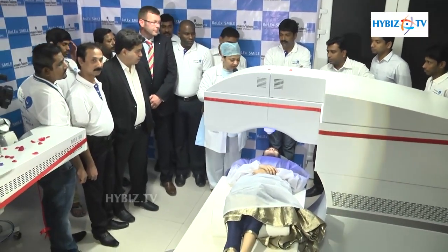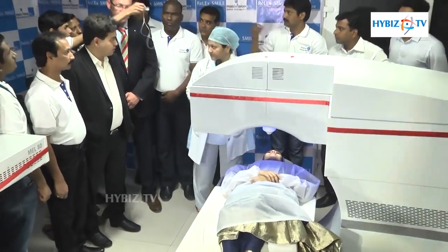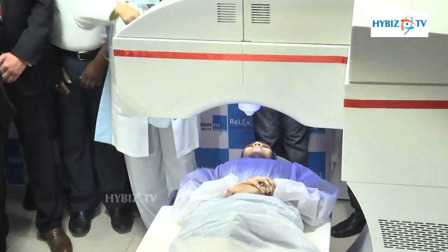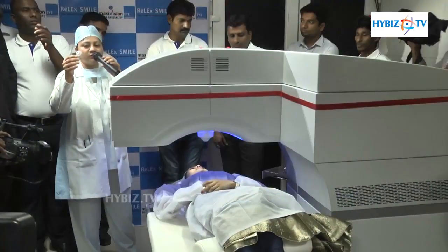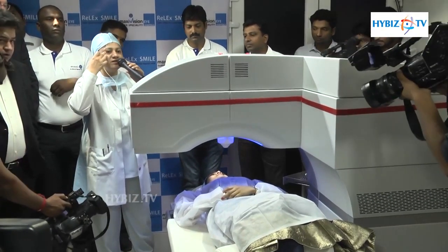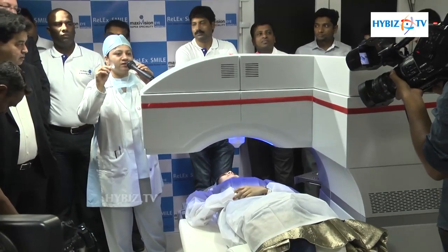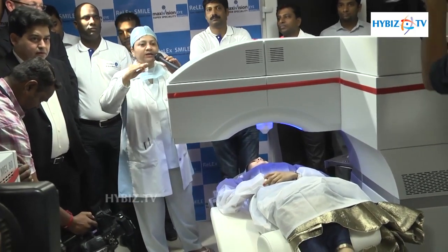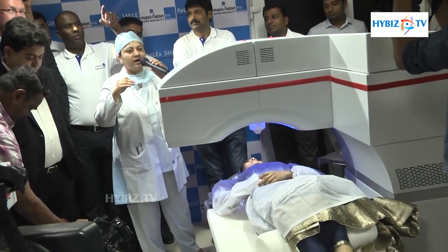We have a cone and we have to fix the cone to the machine. This cone will be fixed on the patient's eye. The cone — this black circle — will provide suction to the eyeball and it will keep the eyeball steady during the laser passing.